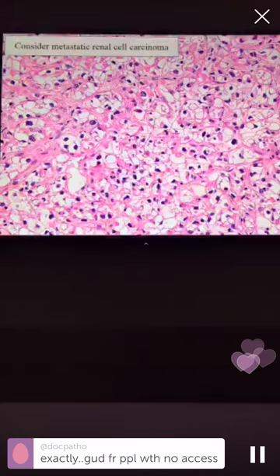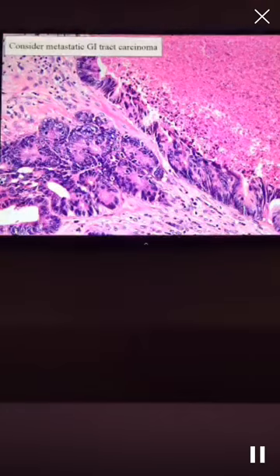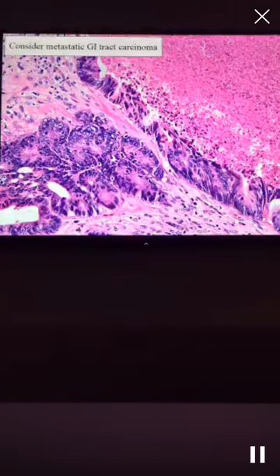So, do I use morphology? Of course I do, right? If something looks like a clear cell carcinoma, of course I ask myself the question, could this be a met from the kidney? But what do you do next? You look for the history, right? So you're back to that stream. You must know whether there's a history of carcinoma somewhere else before you start to throw stains on it. So in this kind of a case, I might do a TTF1 and a PAX8 to differentiate those two. Next. If I see this, you know, there's dirty necrosis at the top right.